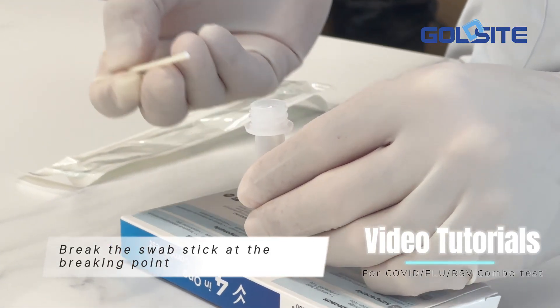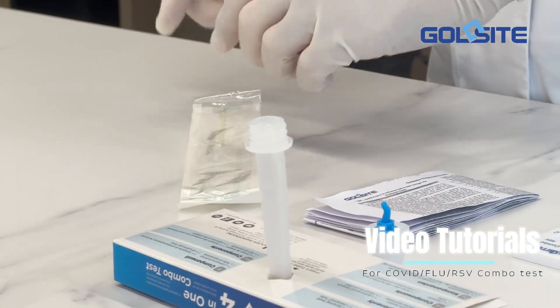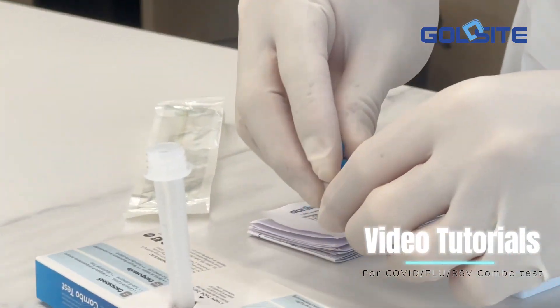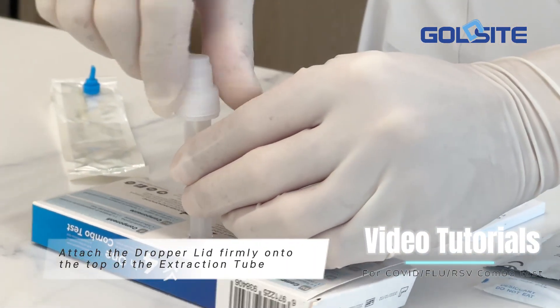Break the swab stick at the breaking point. Attach the dropper lid firmly onto the top of the extraction tube.